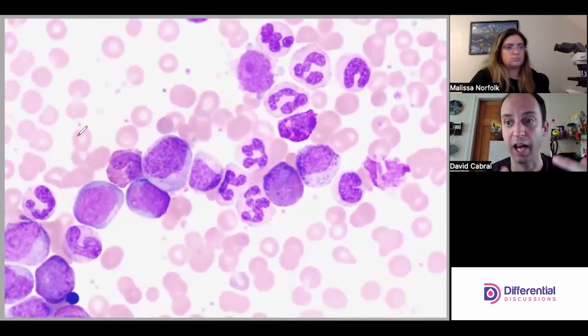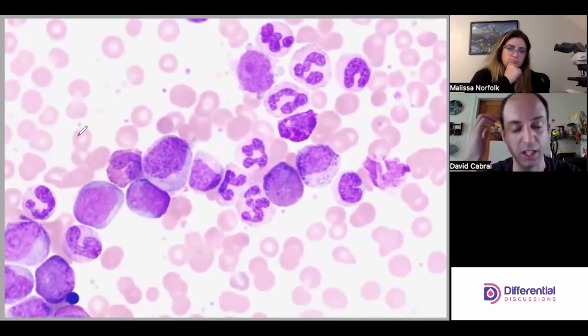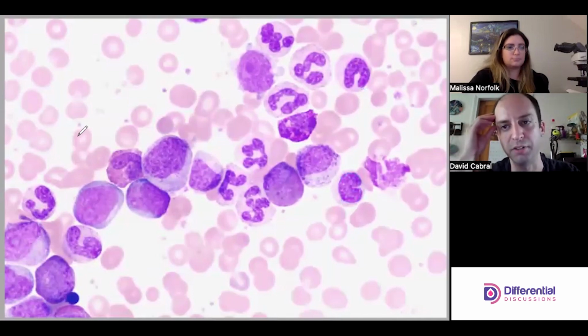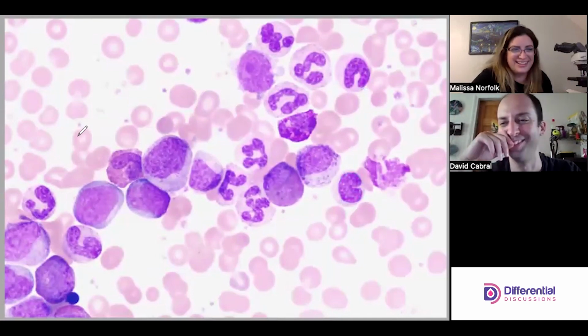So that's where a lot of this want to say bands and immature grans more precisely comes from. But there are so many assays now, and we're getting so good at detecting infections and septicemia, that I think it's of less and less relevance, and we do better to confuse fewer people and standardize training. But that's my little rant. Sorry.